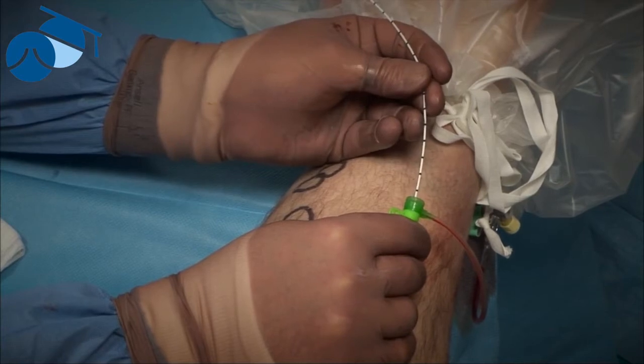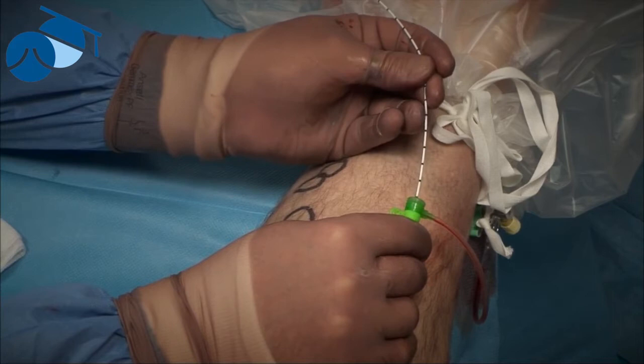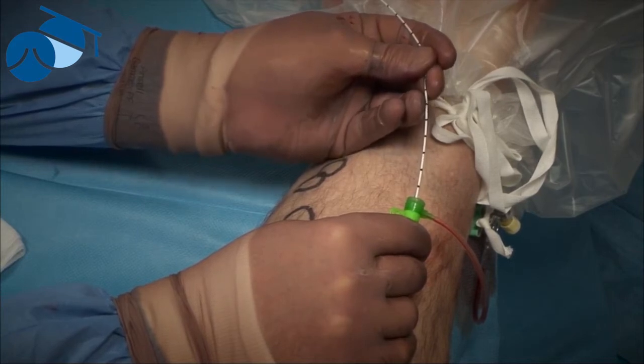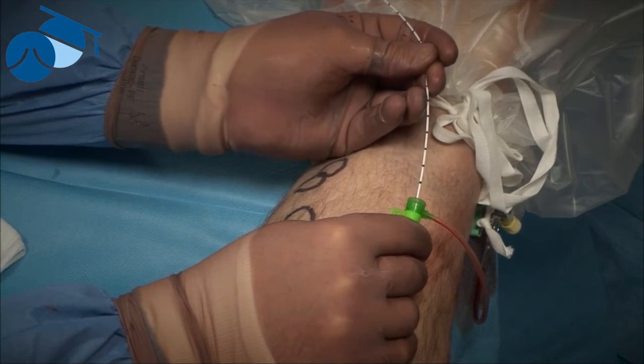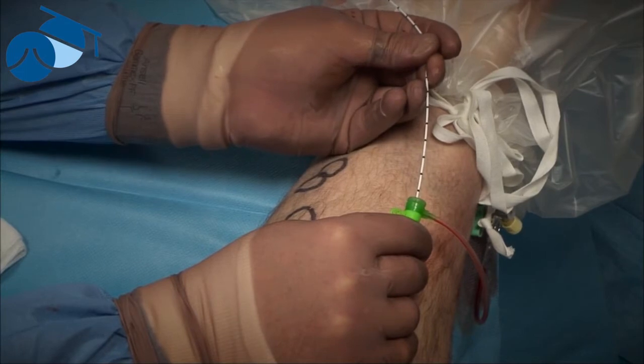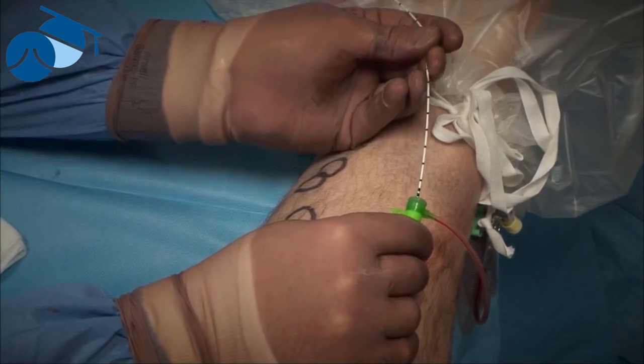There are automatic pullback devices. I've never used them myself because I like to vary the pullback depending on the size of the vein. For a small vein I might be doing 60 to 70 joules per centimetre, a medium vein 70 to 80, and then a large one like this with blowouts, or if it's got thrombus in it or anything else, I want to get right up to the 80 to 90 joules per centimetre.